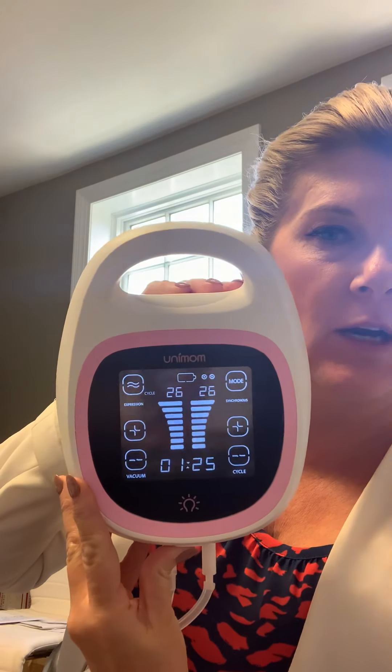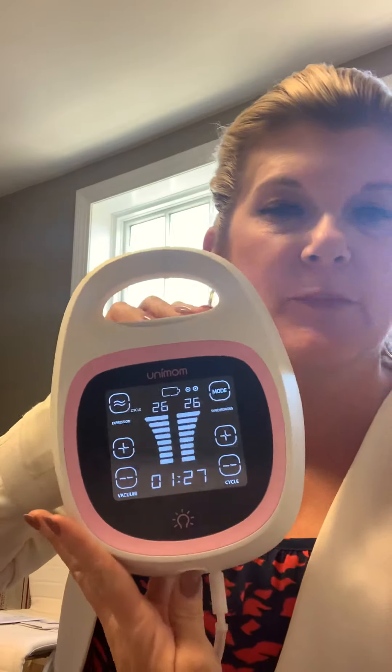Hi, it's Patti with The Breastfeeding Shop. I was asked to do a quick video about the Unimom Opera just so you can see how it operates. I'm going to try to get as close as possible. I've never done one of these before, but this is a great pump.